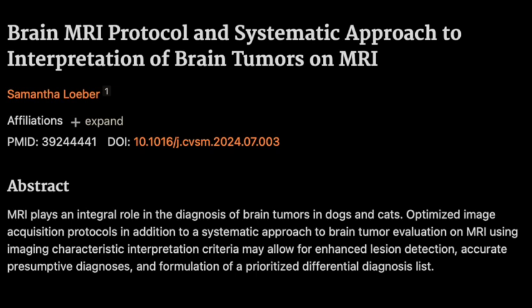Okay, so we've got DWI, perfusion imaging, and tractography. My brain's already working overtime. But the paper also mentioned something called magnetic resonance spectroscopy, or MRS. What was that all about again? MRS. So unlike the others, which focus on the structure of the brain or how it's working, MRS lets us study what the brain is actually made of, chemically speaking.